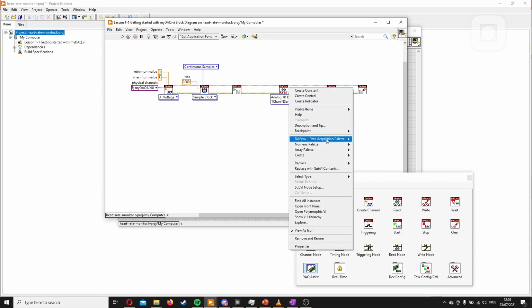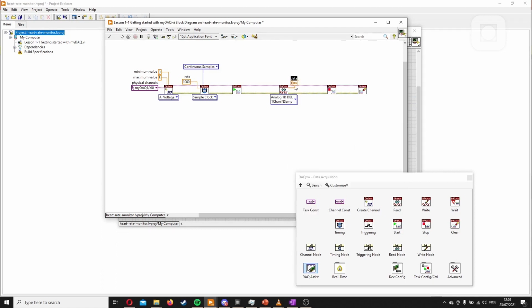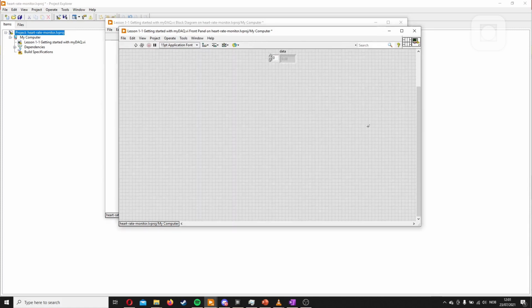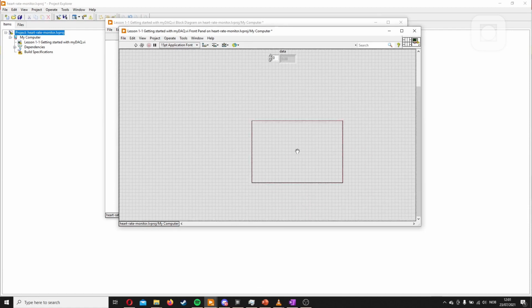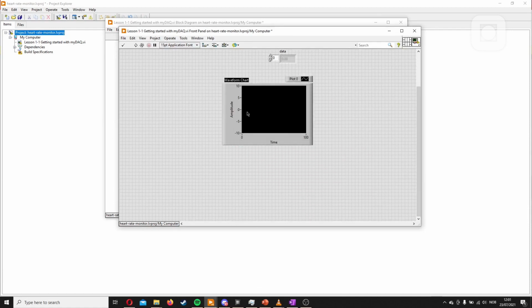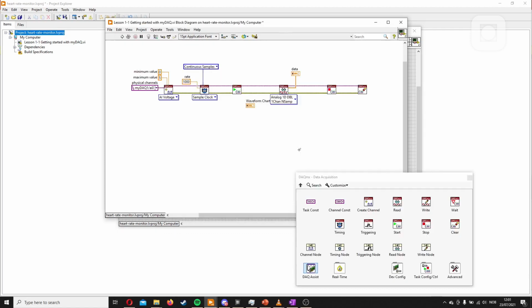We can either create something here, but that will create an array, or what we can do is to go to the front panel and we'll choose a waveform chart. Just because the chart stores the data in there so we can see it over a longer period of time without hassling anything with storing the data for now. And we have it here, so we'll just connect this one here, and that's it.